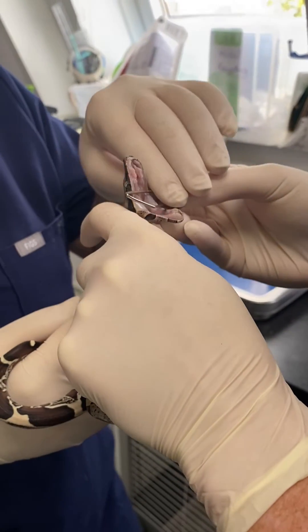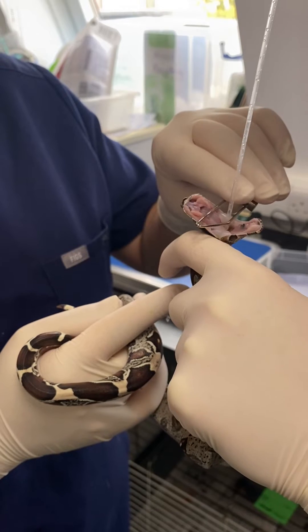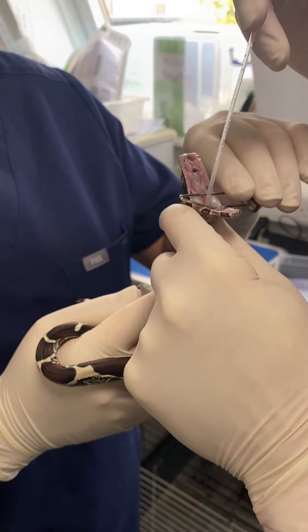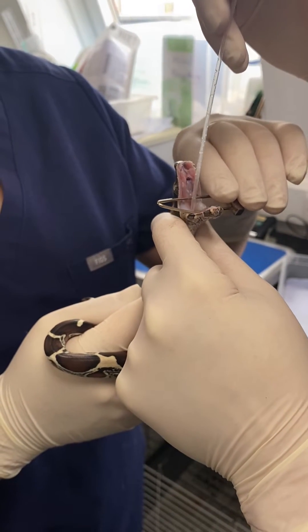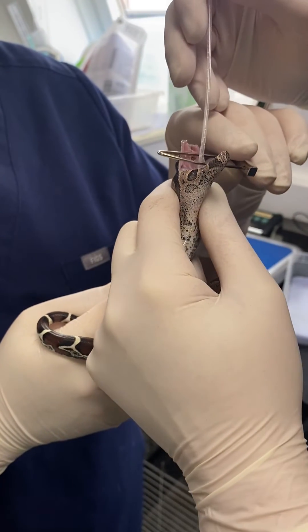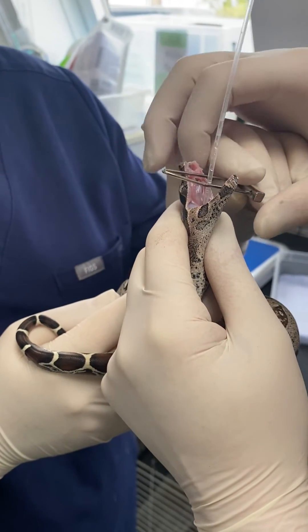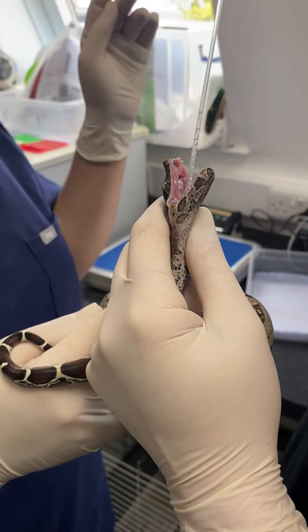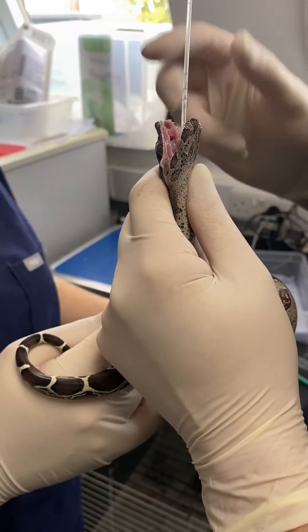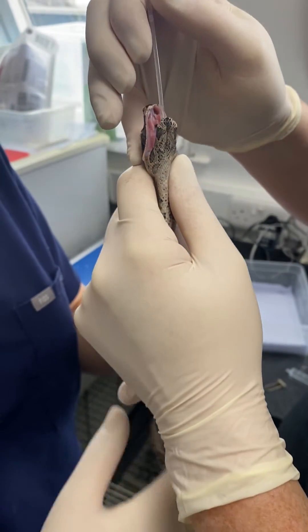Would you mind just holding that for me? I'm just using a 6 French dog urinary catheter and I'm going to gently — okay, you can move the gag up and out of the way now — nice and gently, avoiding the teeth. I'm just going to gently insert this tube down the throat of the snake, then move this up and out of the way.